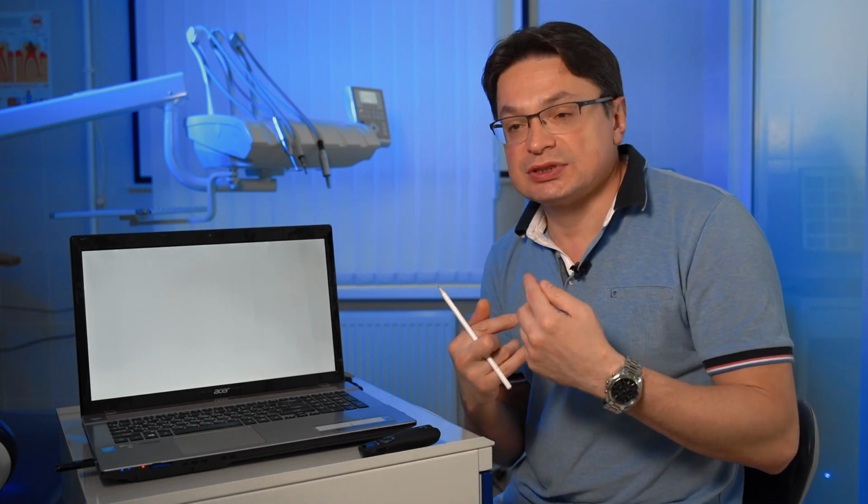But this patient is highly complicated. She doesn't permit us the total prosthetics, but only the back teeth. Of course, later she admitted she liked the work and got the test. She understands there will be no pain, and we finished the work with the front side, which complicated the prosthetic work. Because if we plan it all at the initial stage, we can work with the gums.